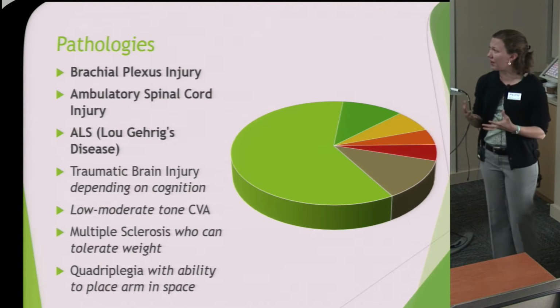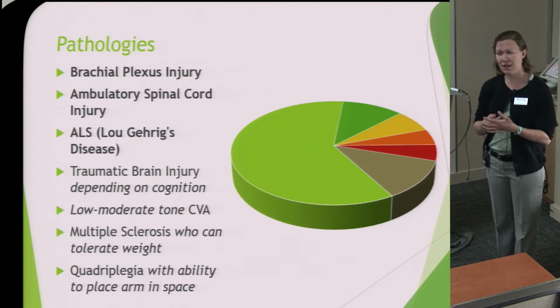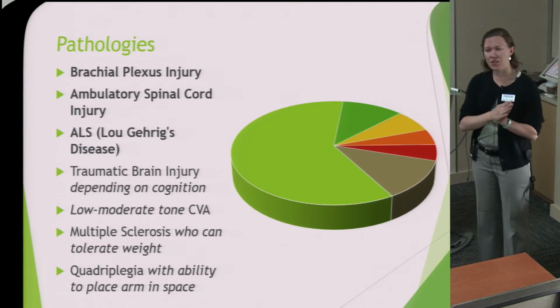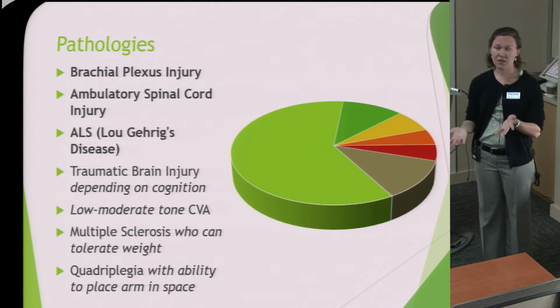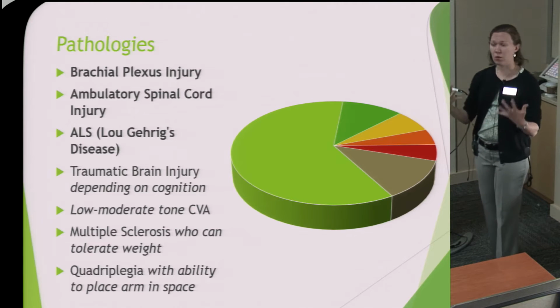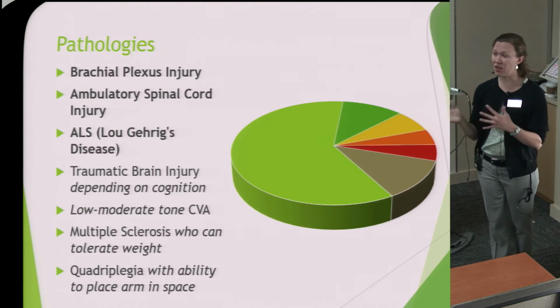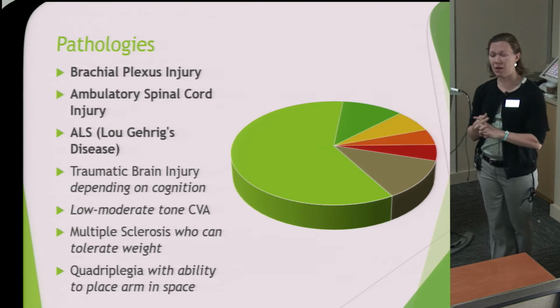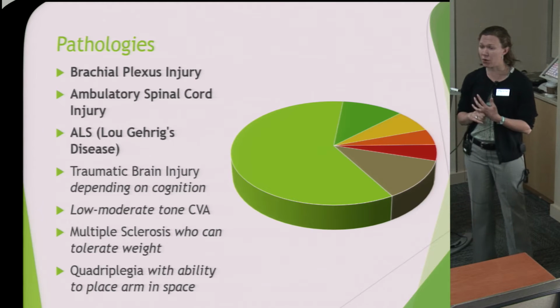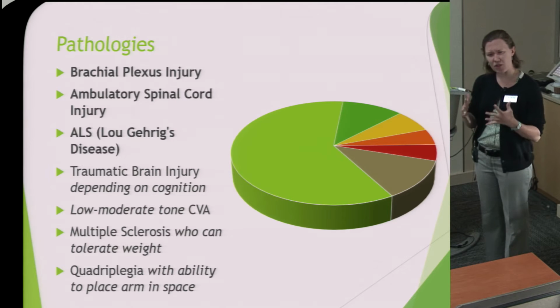If you have patients that you're seeing with ALS, those patients also tend to have some hand function, so they do very, very well with this as well. The caveat to those patients is ensuring that you fit them very early, almost at diagnosis, so that they have the most time to utilize the orthosis. Patients with traumatic brain injury, depending on their cognition, again, with anything that we do in the world of orthotics and prosthetics, we're always trying to check on what is the patient's cognition. Do they have the ability to turn this on, turn this off, understand how it's used, and can they participate in occupational therapy? Patients with a CVA who have low or moderate tone. Patients with really high tone sometimes kind of fight with this a little bit, and they don't get as much functional benefit out of it.